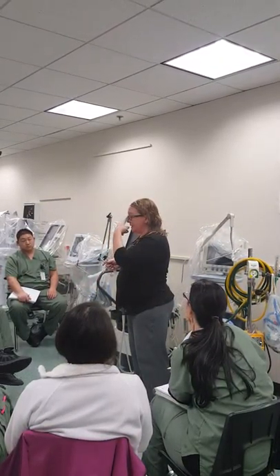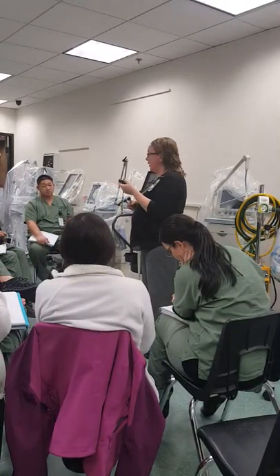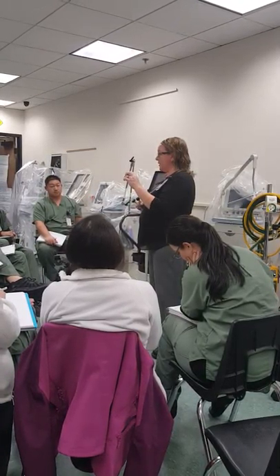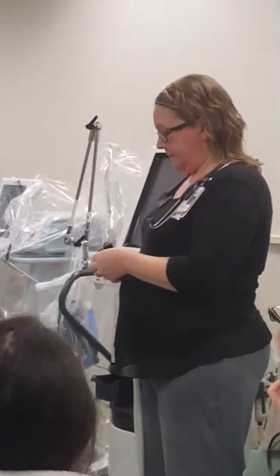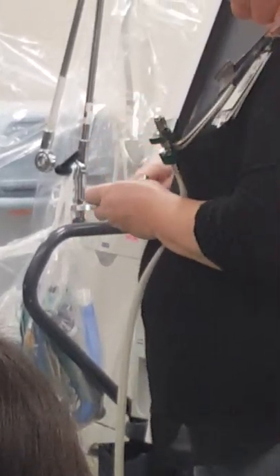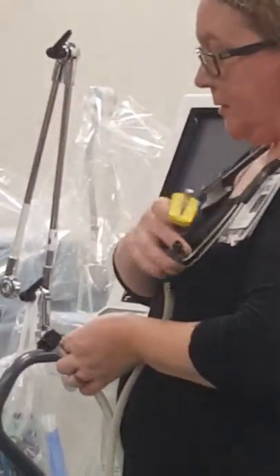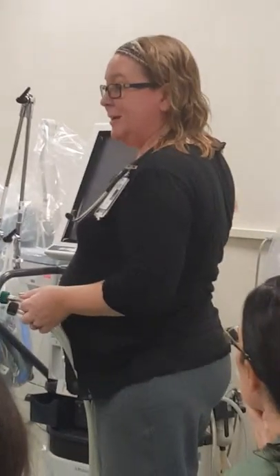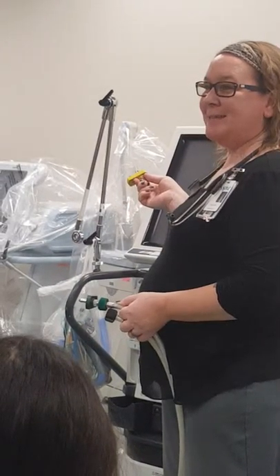Ventilators go out for service sometimes, and the rental company will come in and take equipment, so we want to make sure none of our supplies are on them because these things are not cheap. Some things you have to get out every time we get vents out are the connectors for the air and the O2. You're going to screw these onto the hoses. Caution: do not put either connector — yellow or green — into the wall when it's not hooked up to a hose, because 50 PSI will come shooting out.